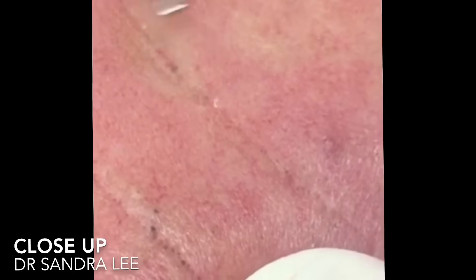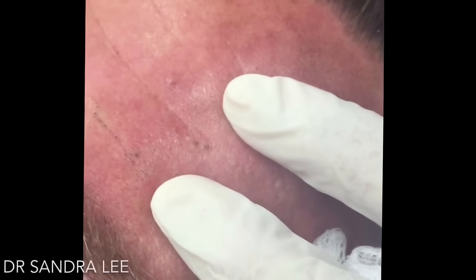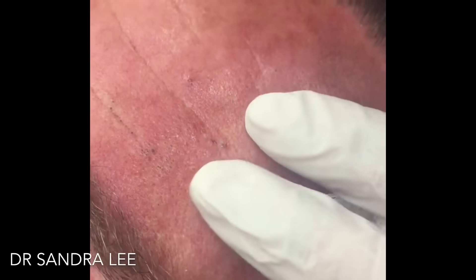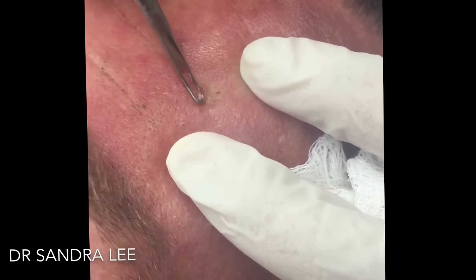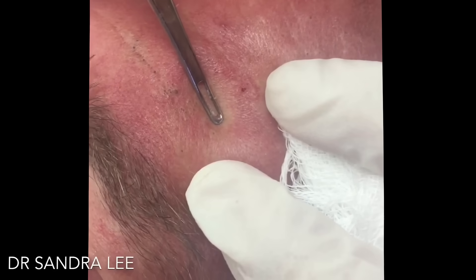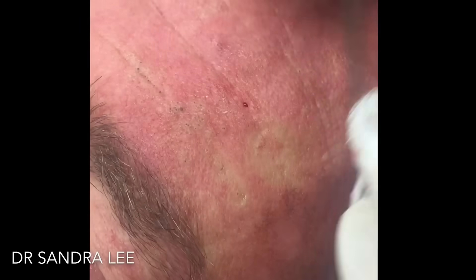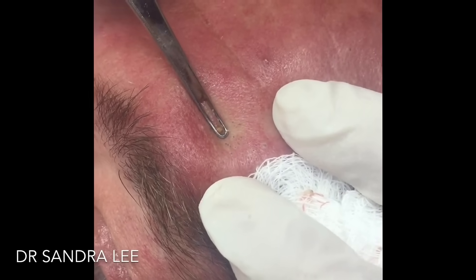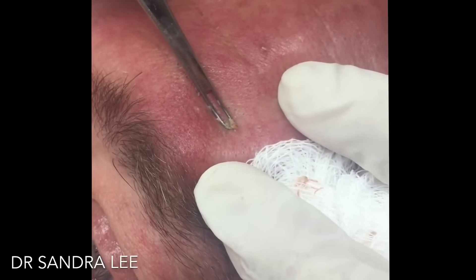Looks a lot better already. How often do they come back, doctor? Sun exposure — I mean, so I think you're gonna get a pretty long reprieve here because I'm sure a lot of these have been here for quite a while. You might start getting little ones but they'll take a while to get bigger again. And if you try to use a little Retin-A like we said, I think we can probably help to prevent a lot of these. There's just a bunch of little ones here, let me see if I can work on them.